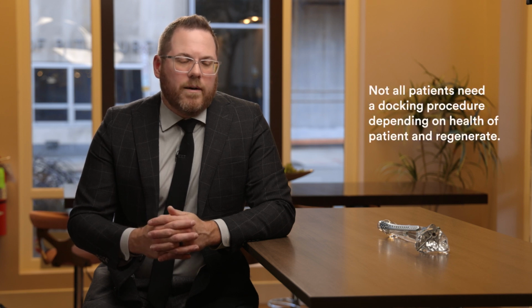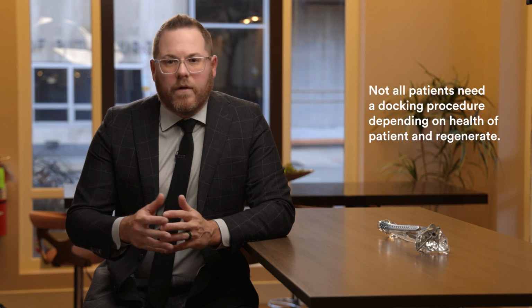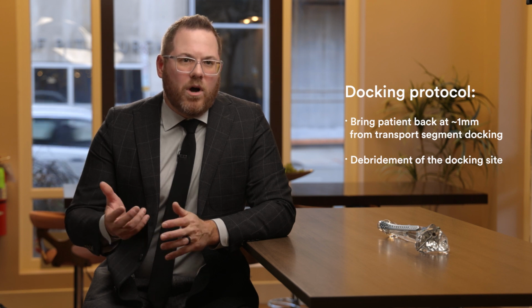There are times where I have not taken the patient back to the operating room for a specific docking procedure. If I see that the tibia antegrade push segment is transporting perfectly in all planes, it's a young, healthy patient with no medical problems, I may not return to the operating room. On the other hand, there have been patients where there is sagittal plane deformity as the transport segment heads distally. I've taken those patients back to the operating room when it's 1 millimeter away from docking. In those cases, I'll make an incision, perform a debridement at the docking site.